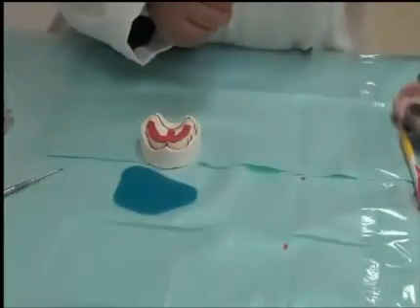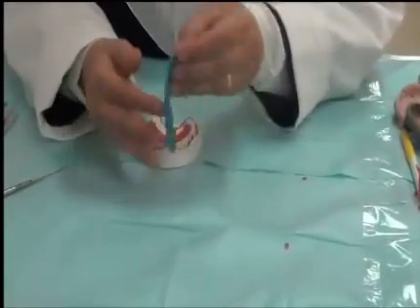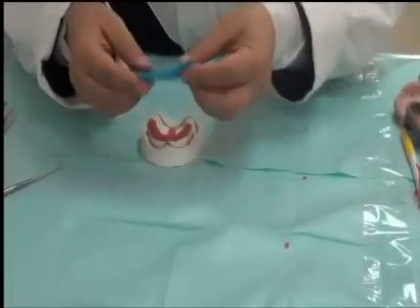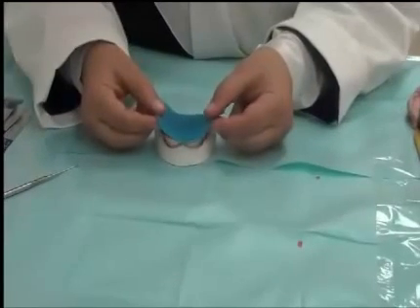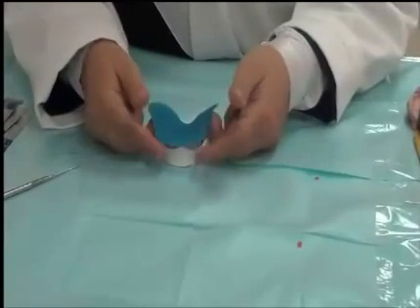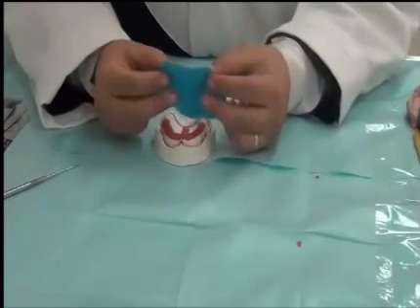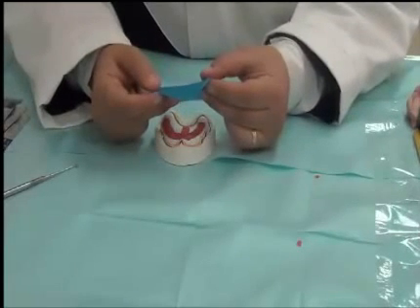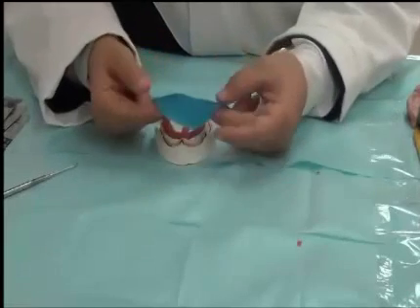We'll make sure the box is sealed, and the sheet we get comes in a shape that corresponds with the shapes of most casts. So it has this outline where the anterior and posterior edges are there. It also has uniform thickness. So although it's like a dough, it has a uniform thickness throughout.